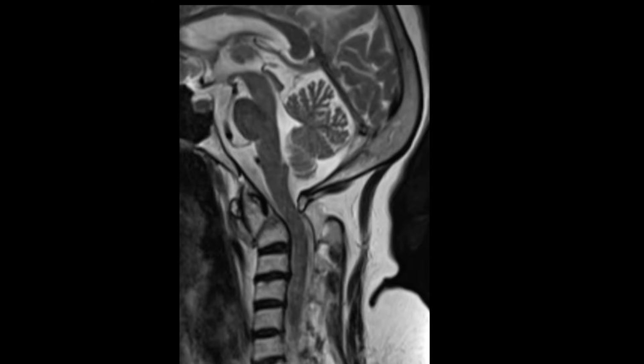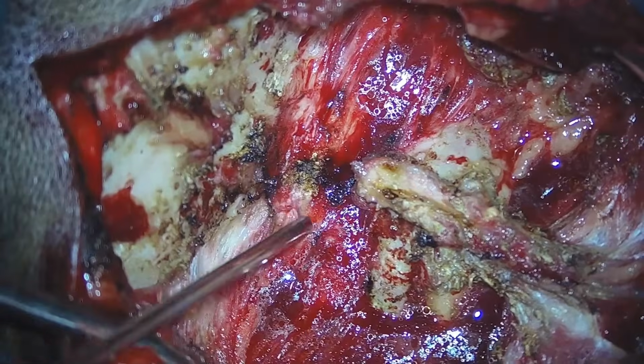which showed there is a beaking in the spinal cord with the displacement of fractured odontoid segment anteriorly. This is causing mild compression of the cervical cord by the C1 posterior arch. So she was planned for C1 C2 fixation with removal of C1 posterior arch.